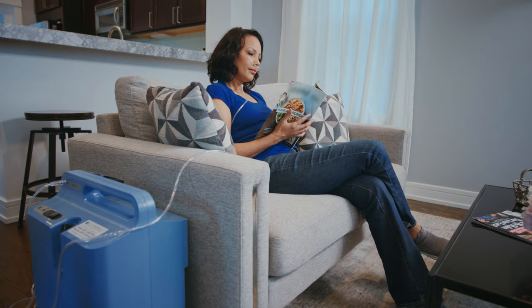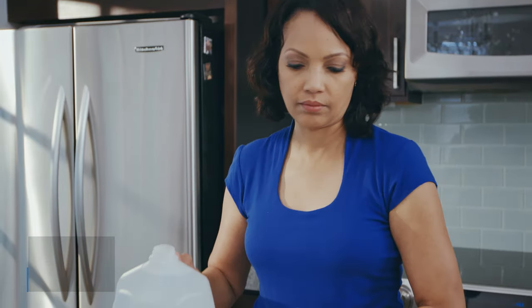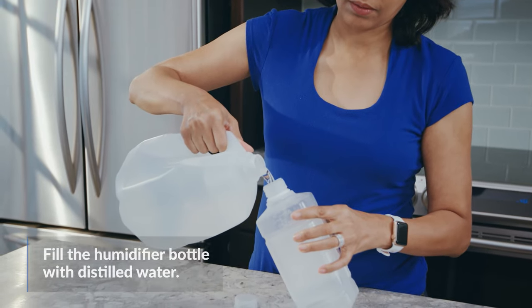Oxygen can be drying to your nose, so some patients use a humidifier bottle that can be attached to your home unit to help moisten the oxygen you inhale. If you use a humidifier bottle, start by filling it with distilled water and attach it to the oxygen outlet.